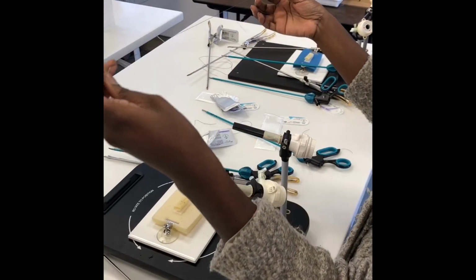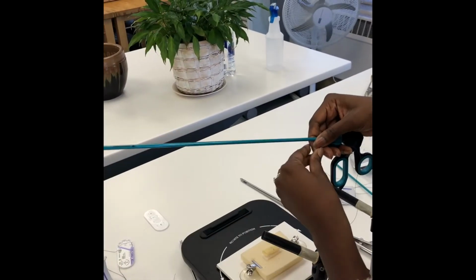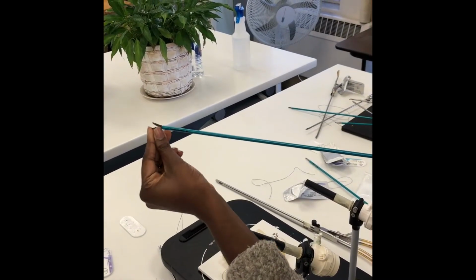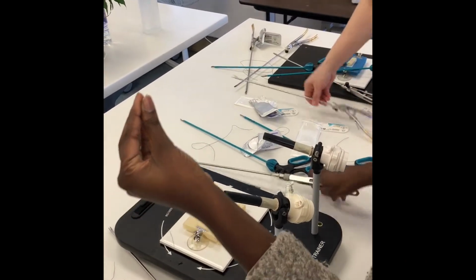Ready? First thing, don't make the suture too long. In general, I usually use the length of any instrument to figure out how long my suture needs to be. And then I cut. All right.